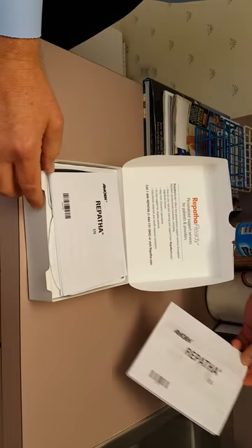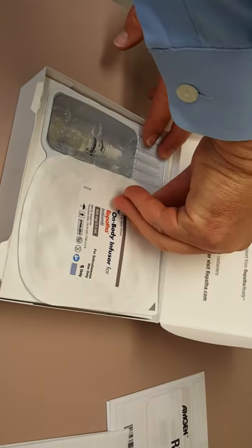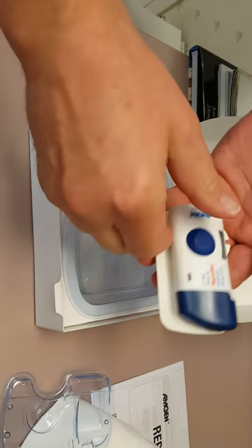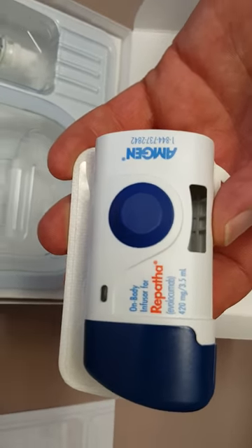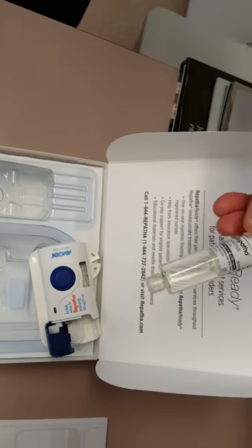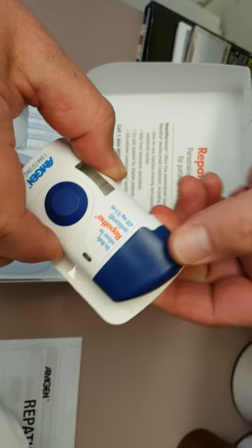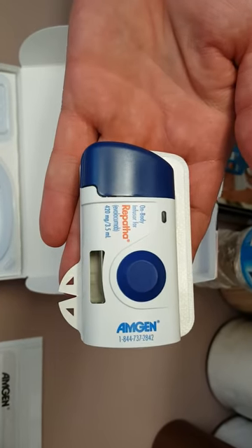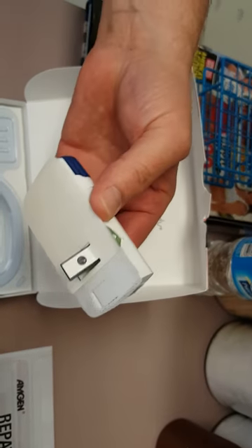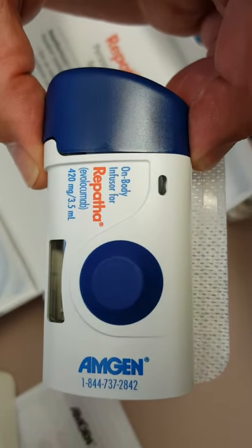So here we are opening up the box, and this is how to set it up. You just peel off the top and then you take the medication — it's actually going to be inserted into the back. You're going to see this is the auto-injector. We're going to put it into the injector like that, and then we're going to close it. Then it's ready to be used — we're going to remove the label from the back, and what that does is it sets up a blinking light which tells you that it's ready to use.